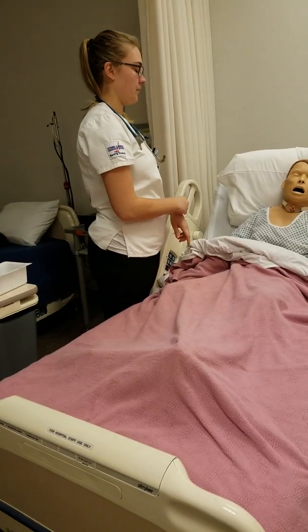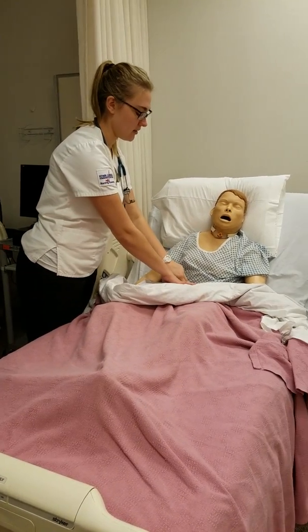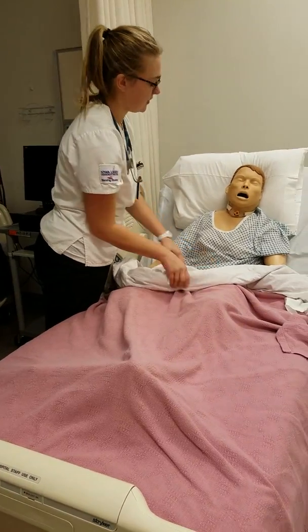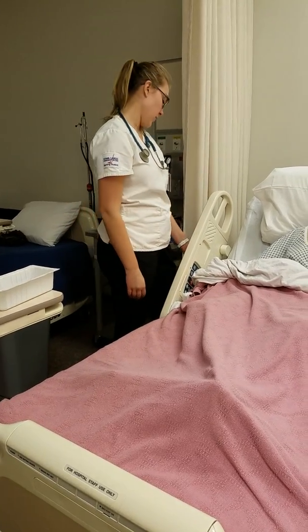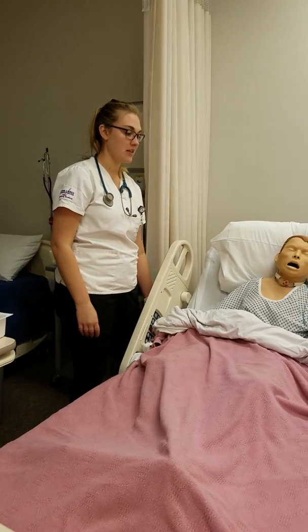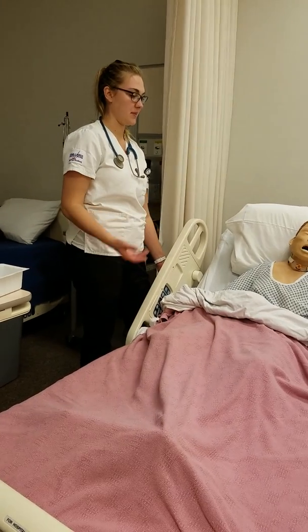And now I am going to make sure that you don't have any more distension in your stomach. Okay. I'm going to lower the head back down. And now remember, Mr. Smith, we don't want to place another NG tube in there. So it's important to keep drinking your fluids. That way we can make sure that there's not a whole bunch of fluid buildup and that you won't have any buildup down there.